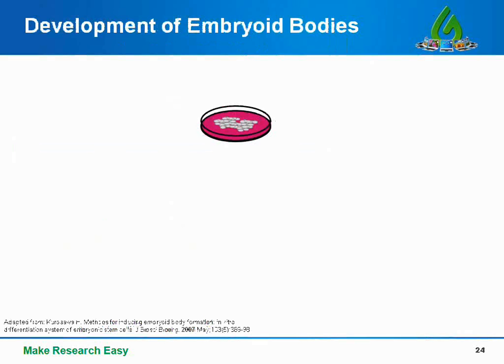So what are embryoid bodies? Well, embryoid body formation is the initial step of embryonic stem cell differentiation. Now to do this, first, any factor that is preventing differentiation, such as FGF basic or LIF factor, should be removed. Now, once these factors are removed, embryonic stem cells will begin to differentiate and form spherical aggregates known as embryoid bodies, which consist of future endoderm, mesoderm, and ectoderm tissue. Now there are various methods to regulate the formation of embryoid bodies.